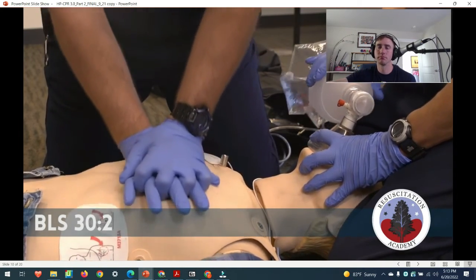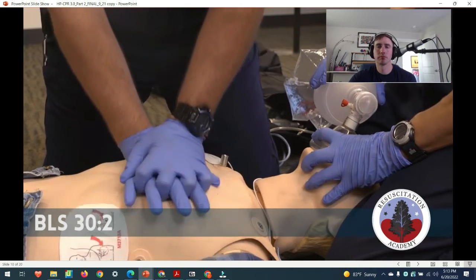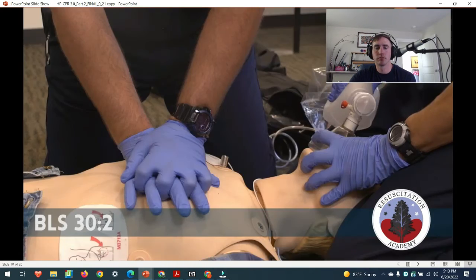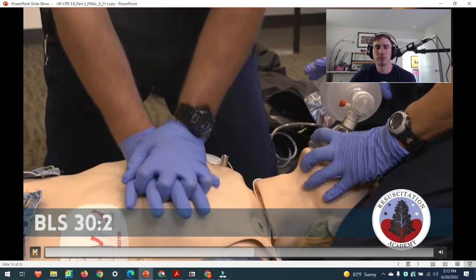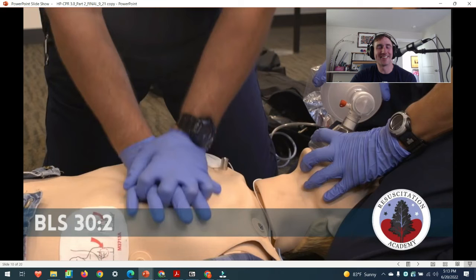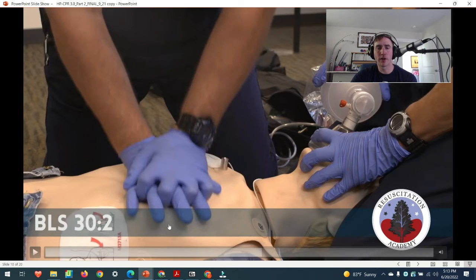26, 27, 28, 29, 30. Got good ventilations with that. So the problem with this video is that he squeezed the BVM way much too hard, and he knows that. But it's kind of a good demonstration of what you don't want to do, and sometimes we need that. But the compressions were great. The pause was pretty short.